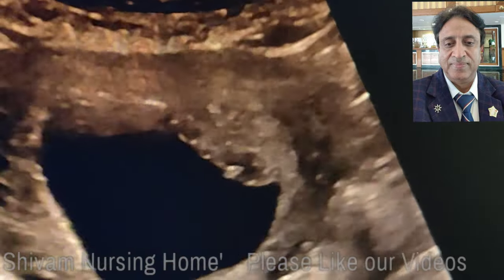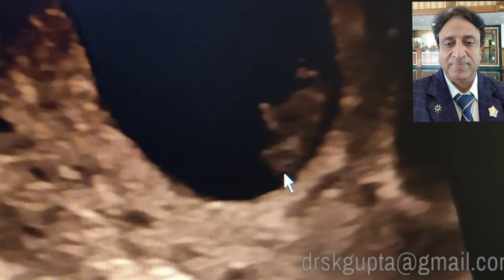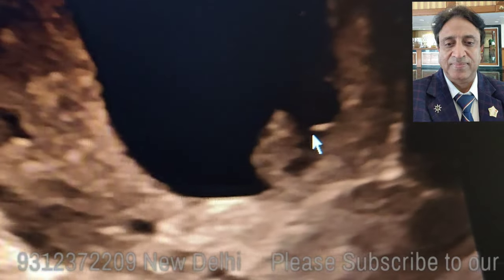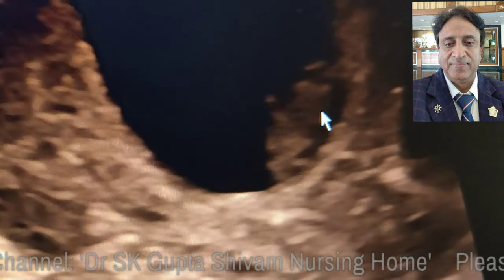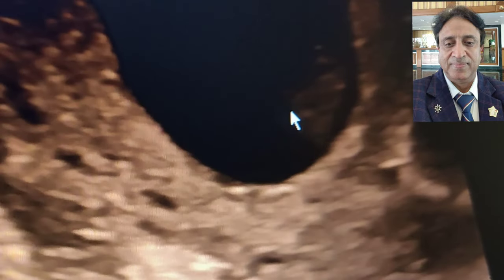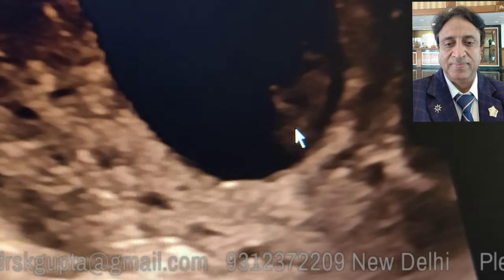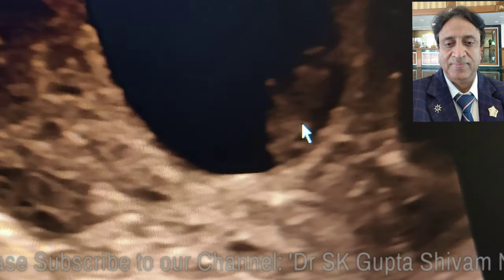Now we come to the other features. The most important feature is the absence of cardiac activity. You can see here the fetal pole, or the fetus, which is an amorphous, crumpled fetus and does not show any cardiac activity. If I try to see it at low frame rate, the heart is supposed to be here but does not seem to be beating. These appear to be the upper limbs and this appears to be the head of the fetus, but there is no cardiac activity. This is another very important feature which suggests that we might be dealing with a missed abortion.